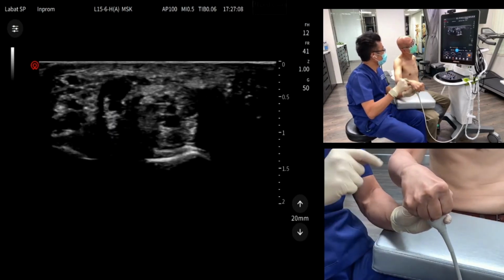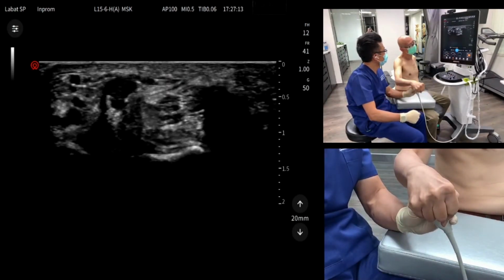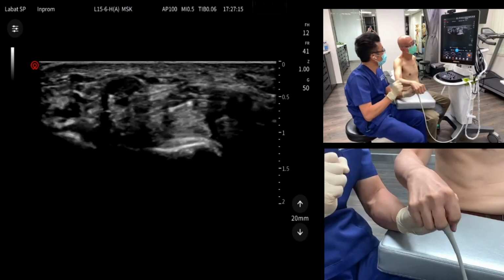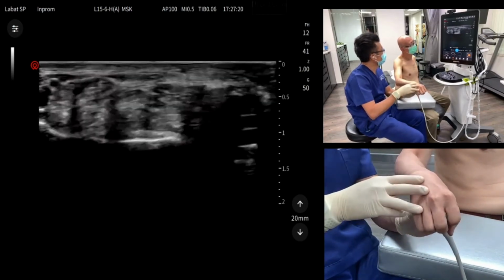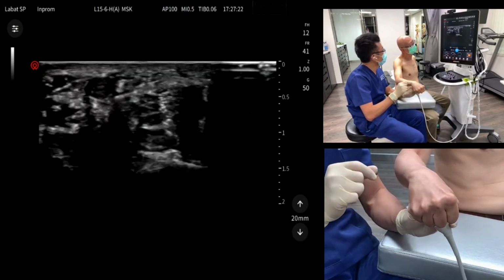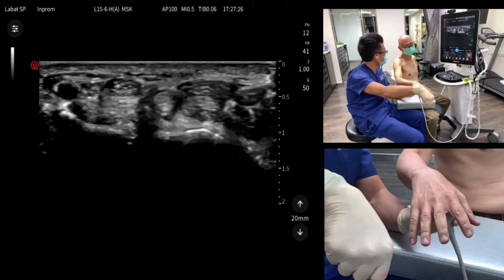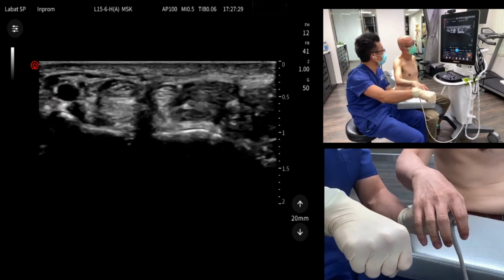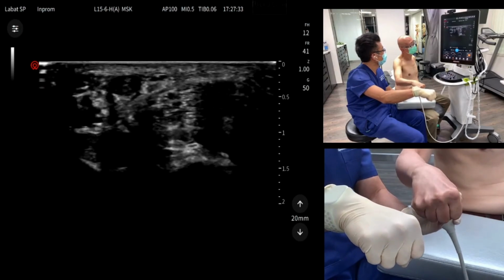So, do you have numbness now? Not yet. Okay, probably when you squeeze that for 100 times, you're going to develop numbness because you're prone to this carpal tunnel syndrome because each time when you're doing this, you are squeezing your median nerve between the flexor pollicis longus and now you escaped. Now you come in.